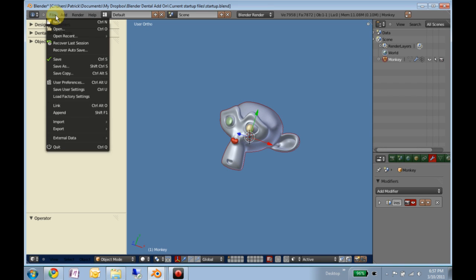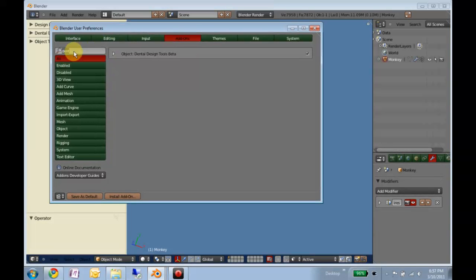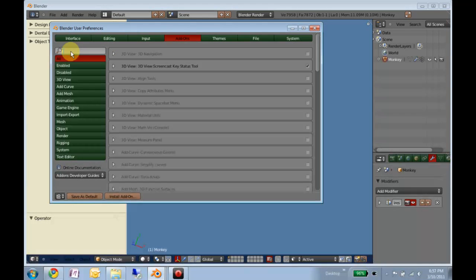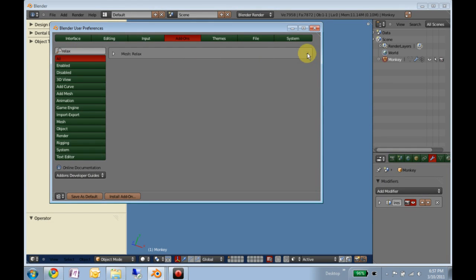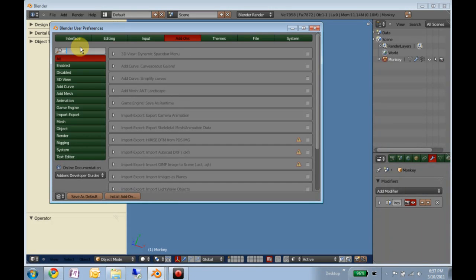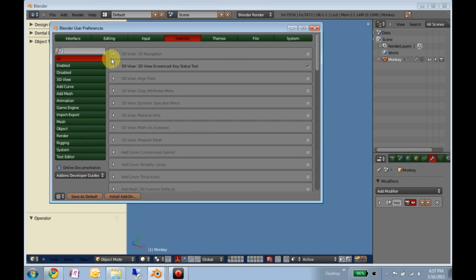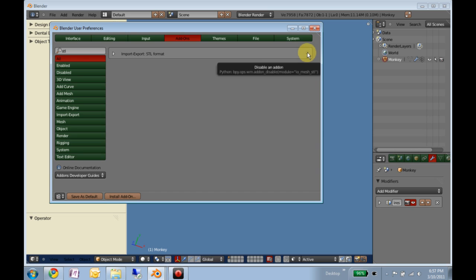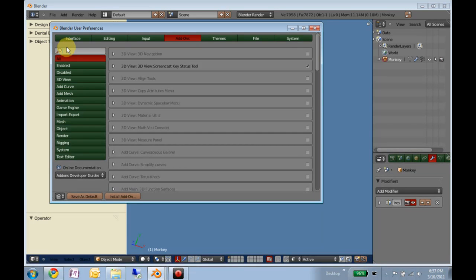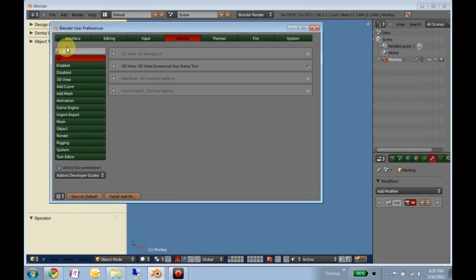So you also need the mesh relax add-on, the import STL, and the 3D view navigation.